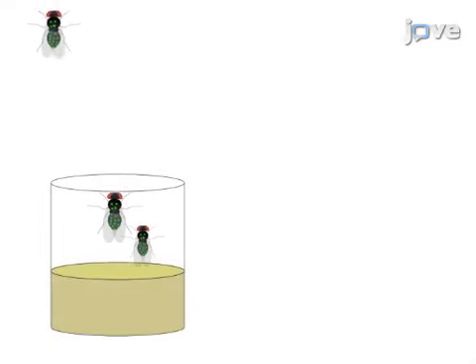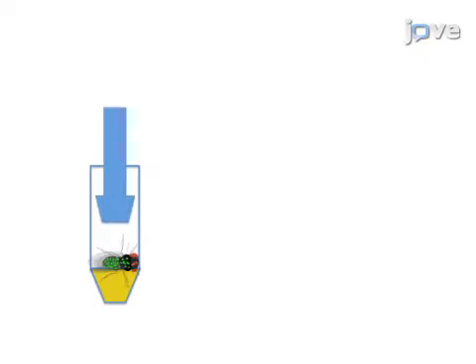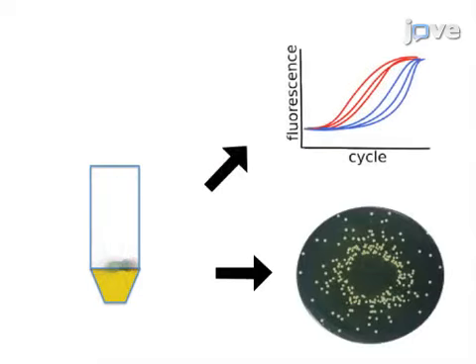This is accomplished by first delivering the bacterial infection into the flies using a nanoinjector. Host mortality can be tracked post-infection over time, and the systemic bacterial load can be determined at any point by homogenizing infected flies and measuring the number of bacteria present. The host immune defense can also be quantified by measuring the expression level of antibacterial peptide genes.